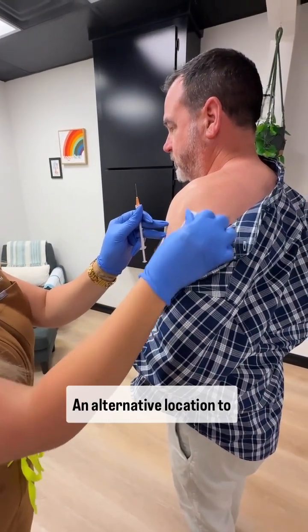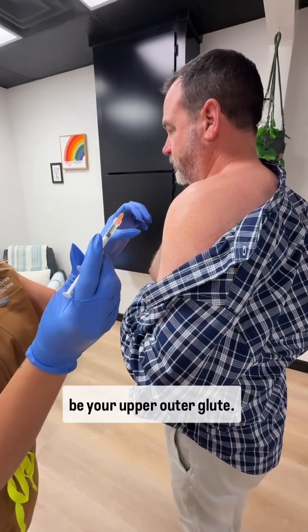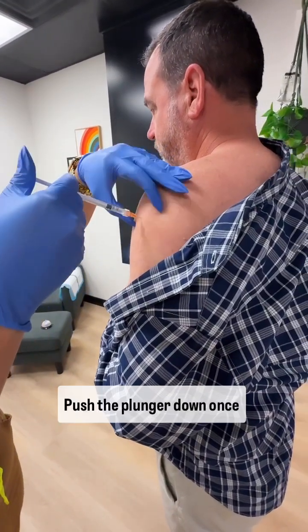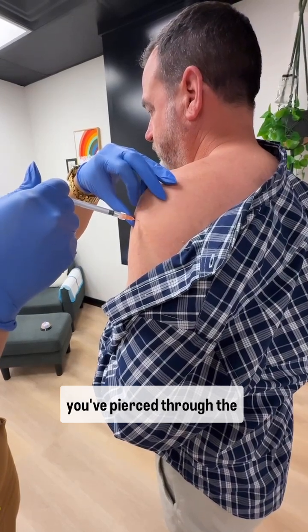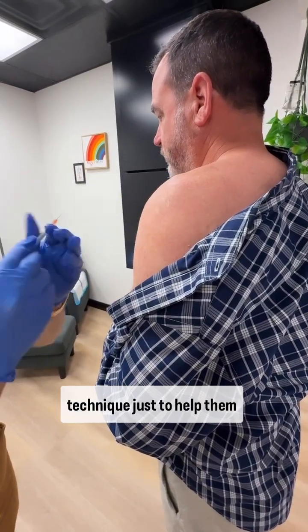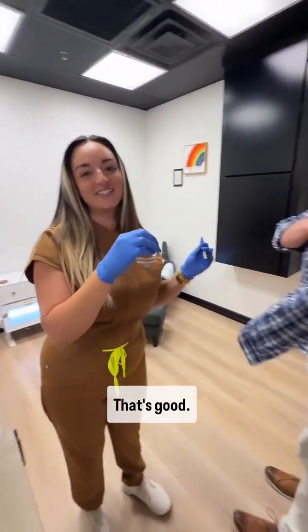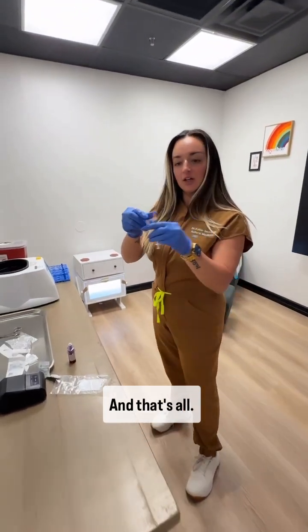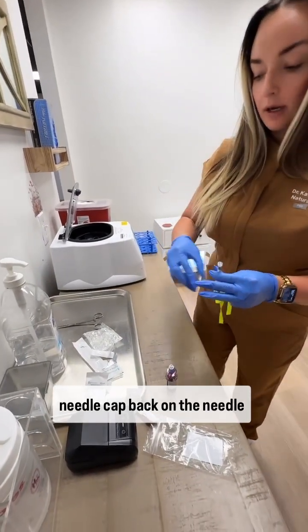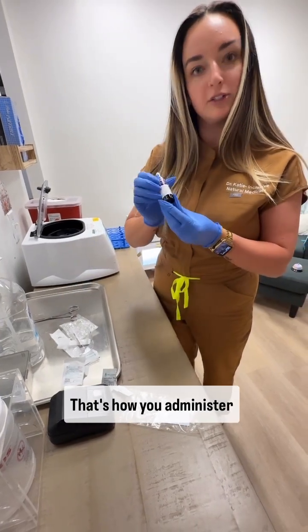An alternative location to inject would be your thigh. And another alternative would be your upper outer glute. Here we go with the injection. Push the plunger down once you've pierced through the skin. I do a little scratching technique just to help them not feel it. Did you feel it? I did not. Okay, good, that's good. We didn't pay him to say that. And that's all. Of course, you can put your needle cap back on the needle and then dispose of them appropriately. That's how you administer your testosterone.